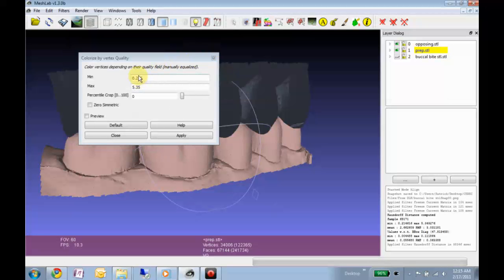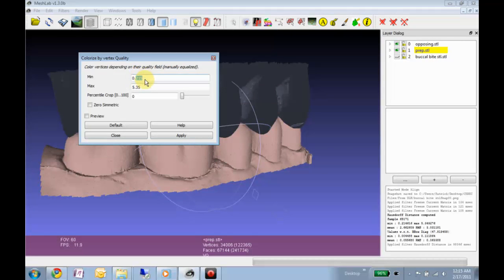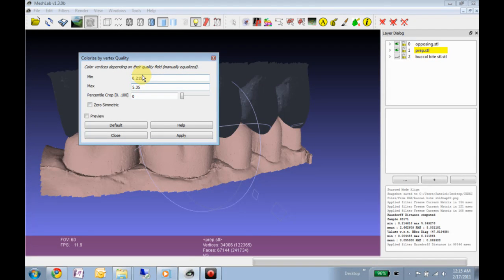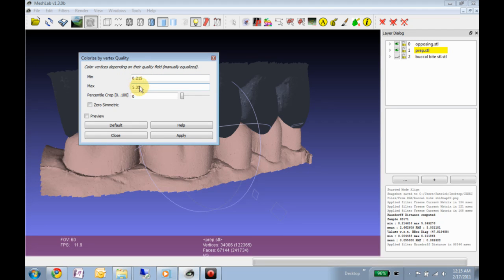Alright, so apparently it ranges from 2 tenths of a millimeter to 5 millimeters, so that's 200 microns to 5,000 microns, which means that these meshes aren't really touching.